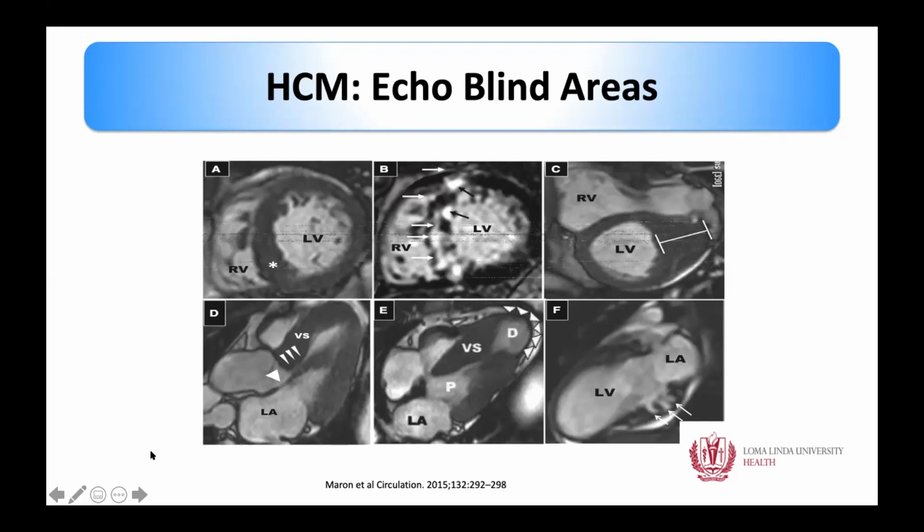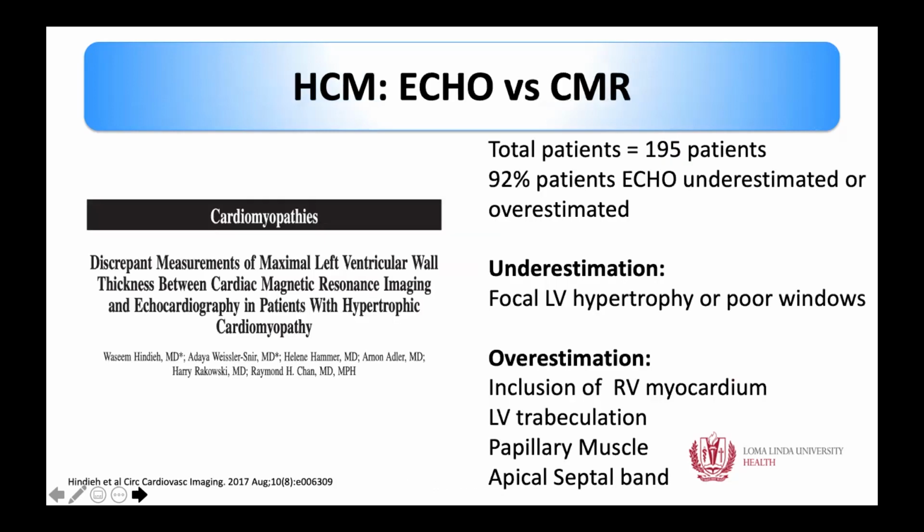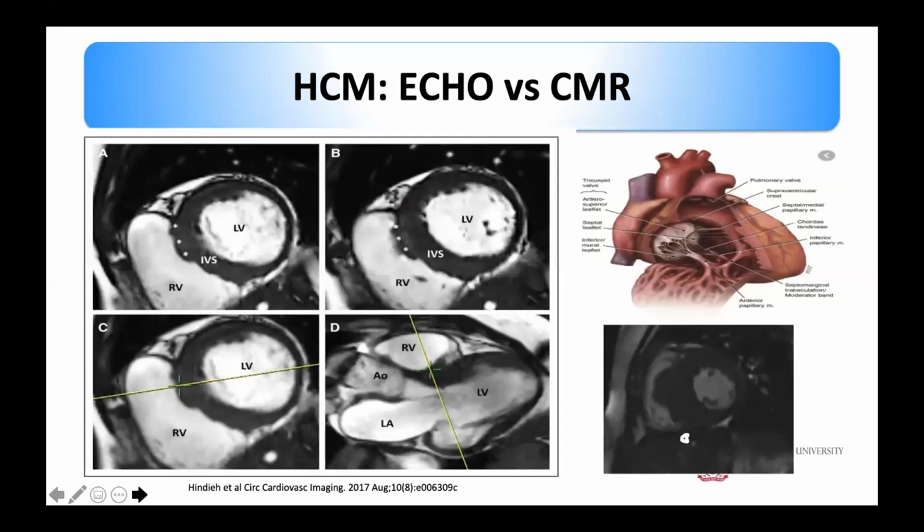So just be careful with calling the diagnosis of no HCM, particularly in patients who have a family history, without advanced imaging. There is a very well-known discrepancy of the LV thickness between echo and MRI, and I won't go into details, but I just want to show you all this phenomenon.